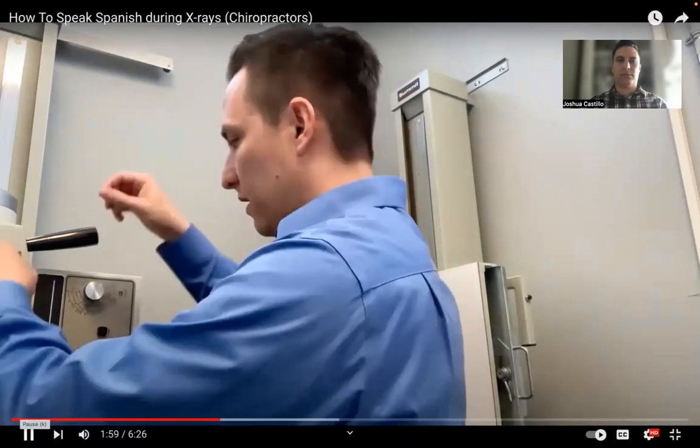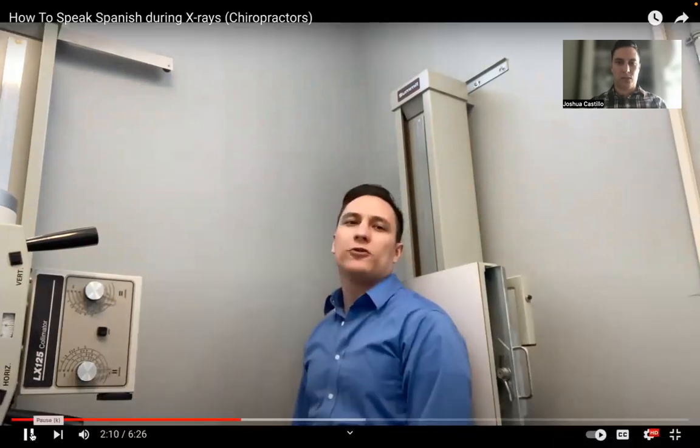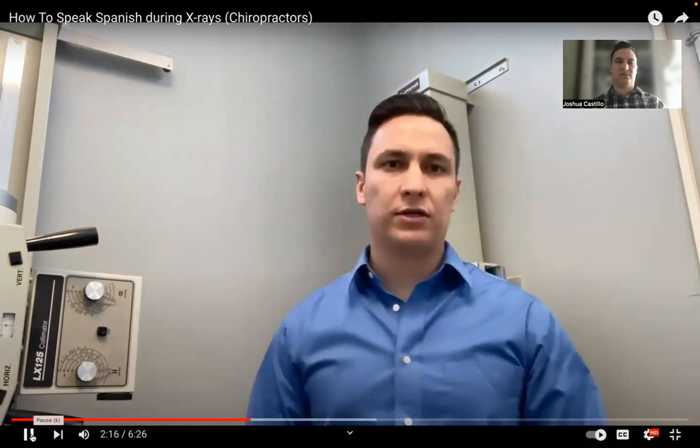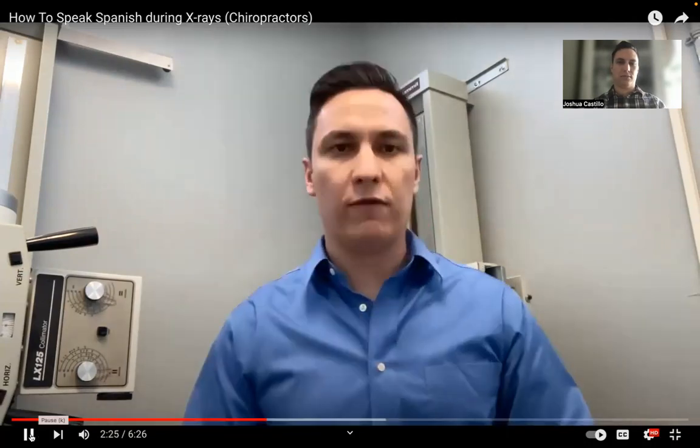I don't really go through how I'm gonna position the x-ray. I just tell them where they have to be and where they need to stand and how they need to position themselves. So at the beginning, I'm taking all my A to P films. I'm doing my thing here with the vertical horizontal. Whether it's AP, let's say cervical, and I ask them to look down or look up, for example, so that we can see all those uncovertebral joints. I might say, repite por favor, right? Anything you want them to do, just say, repite por favor, because they're going to repeat what you're doing. So if you want them to look up, just say, repite por favor. And if you want them to not move, just stay still, you just say, no te muevas, right? And then you run over, you do the x-ray.